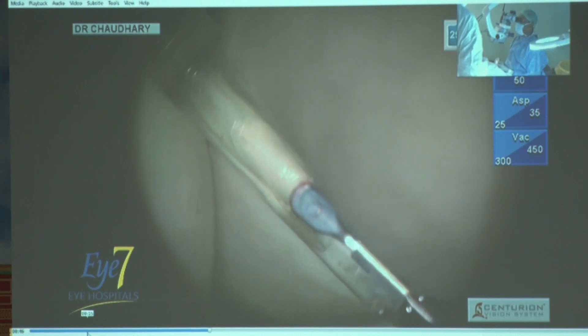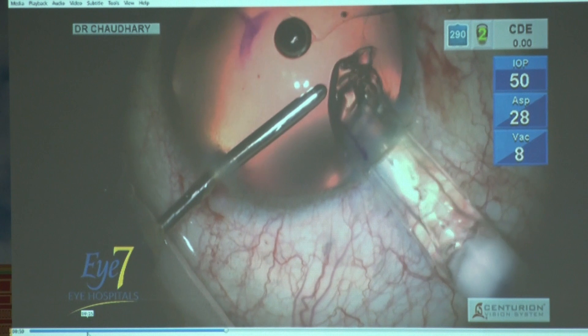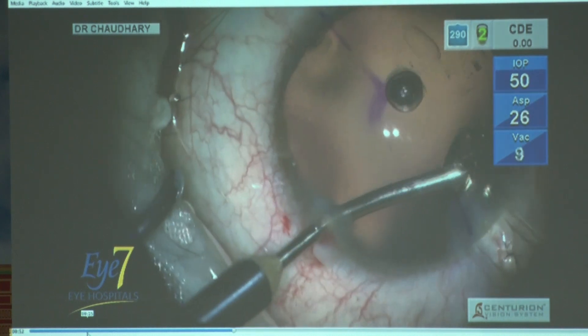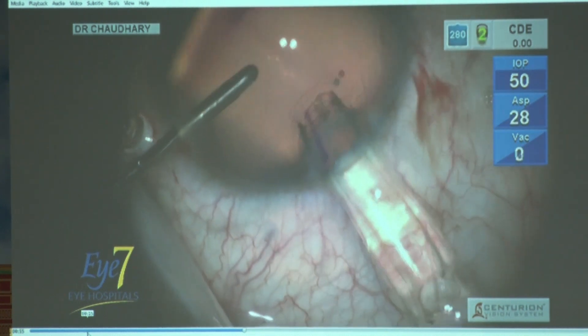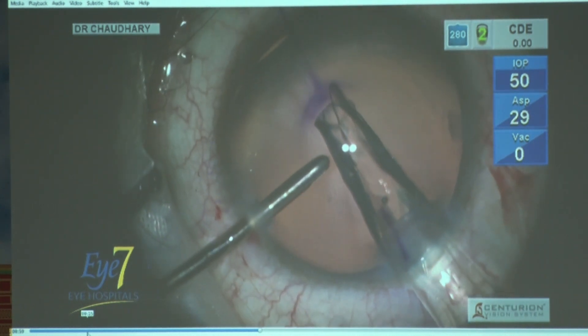This lens was almost in the center, but see the way the lens is coming out — it didn't load well. If it doesn't come out well, immediately take it out. Don't push it through. Reload it and then inject it.